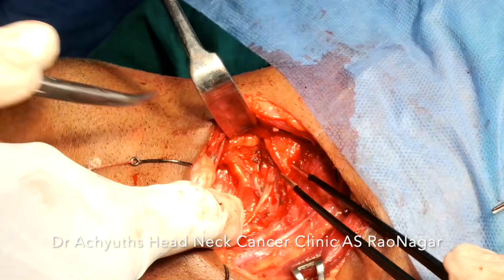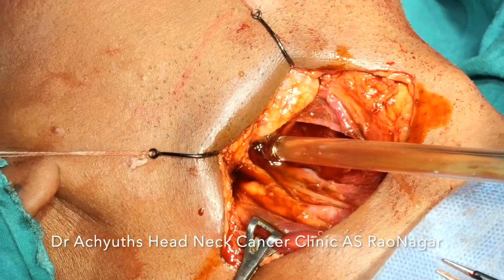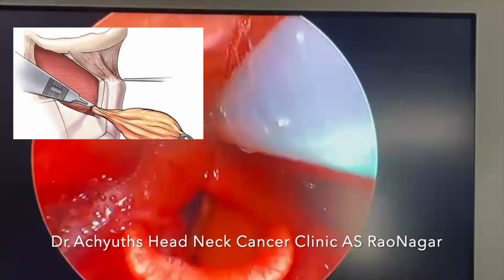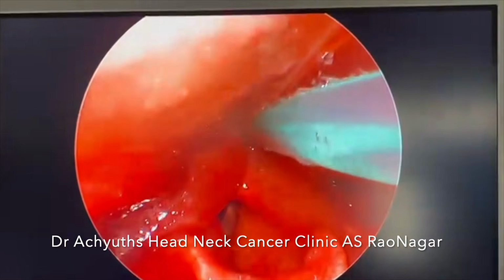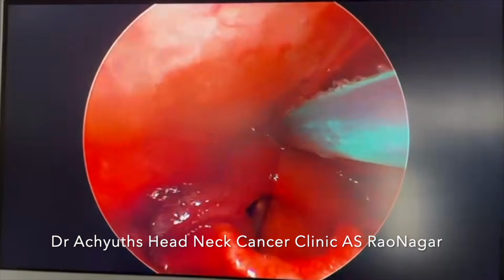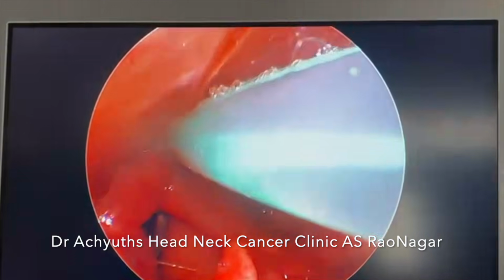Now these muscle structures, they are repaired, a thorough wash, repair of the structures, and then closure. This patient was doing very much fine in the post-operative period. We have done video laryngoscopy. The voice was intact, the patient was not aspirating, but preemptively we put a Ryle's tube. Patient is doing good. He has been discharged in a very satisfactory condition.